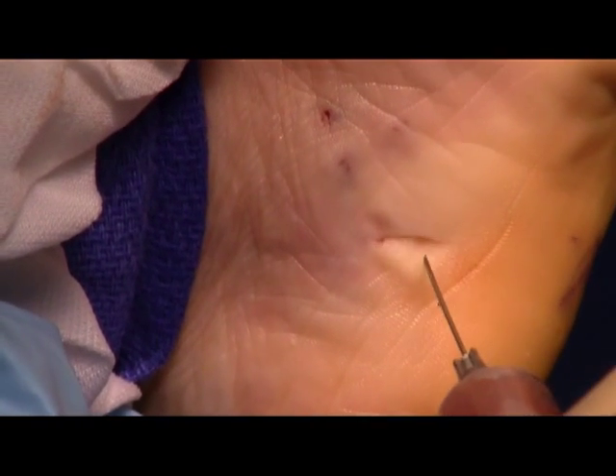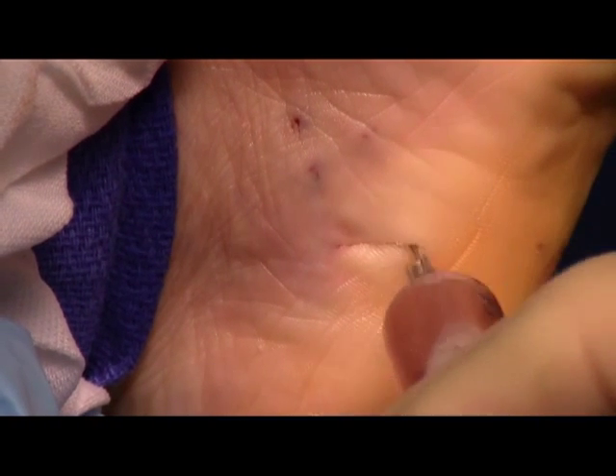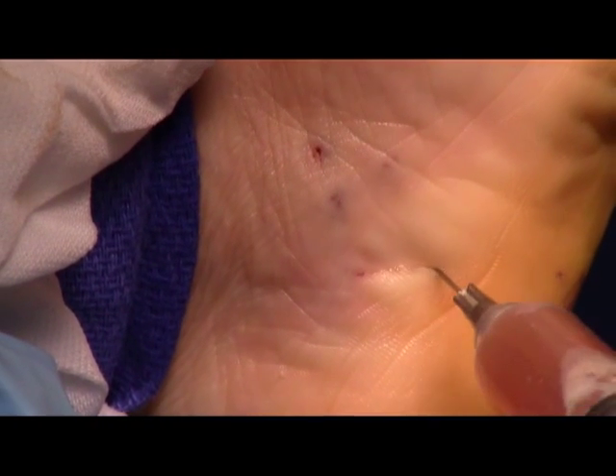We're going to take a look at the platelet-rich plasma, which will also help with healing.